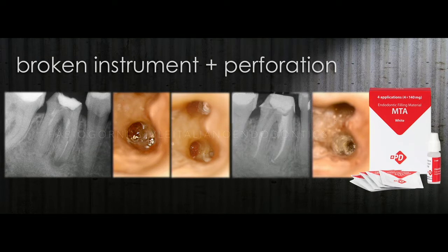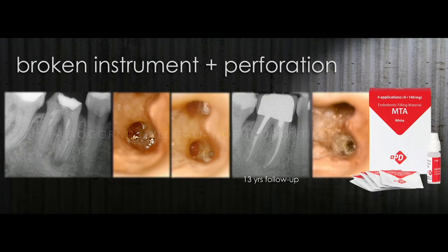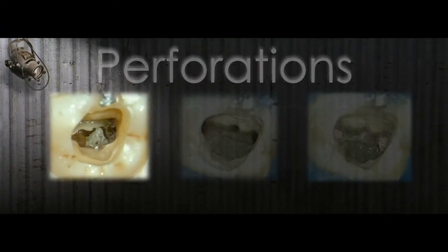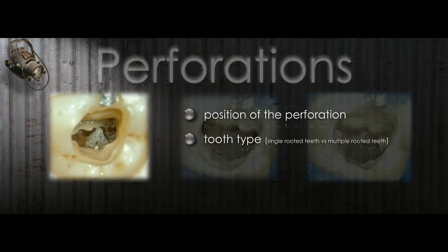This is the post-op after the treatment and the follow-up after 13 years. Thanks to the MTA, today we can solve a lot of problems, and one of the biggest problems is perforations. When we are talking about perforation, we have to understand exactly some points.